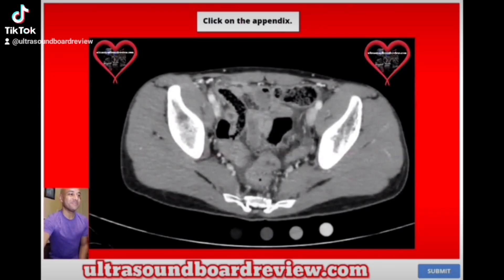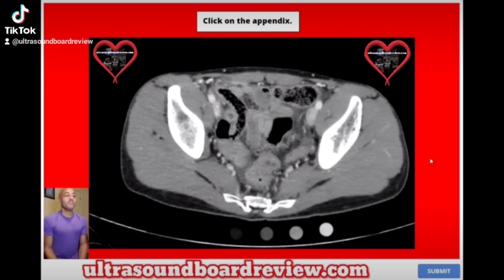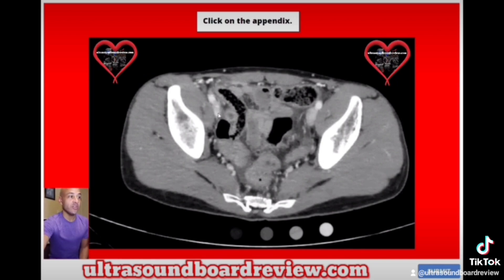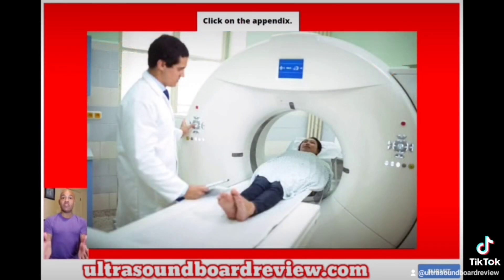Click on the appendix. So where on the CT is the appendix? The answer is right here — this is the appendix right there. This is a picture of a patient lying flat on their back. This is the right side of the patient, this is the left side, this is anterior and this is posterior, with their feet closer to you.